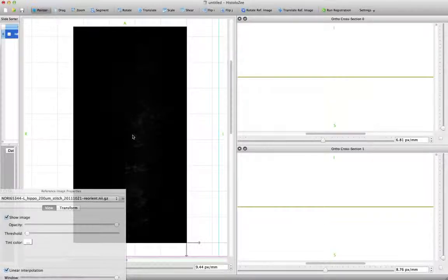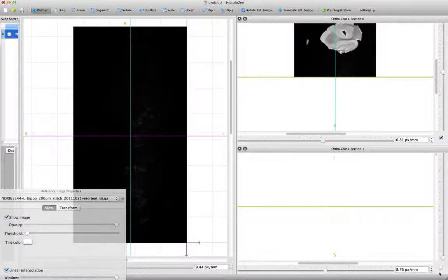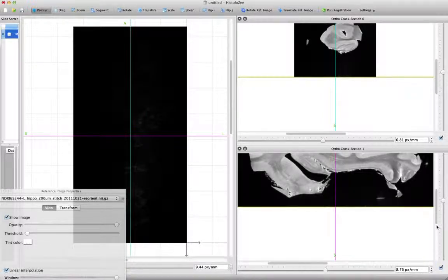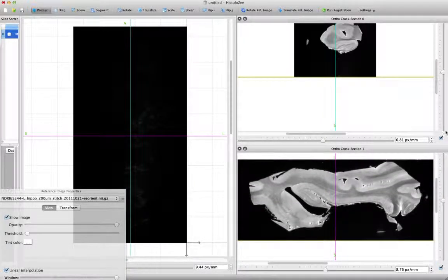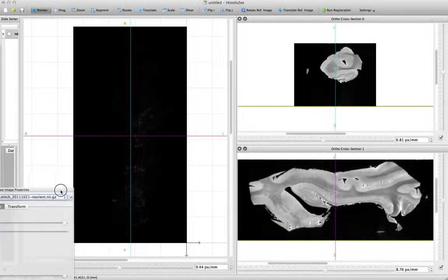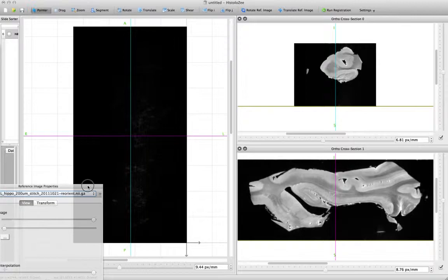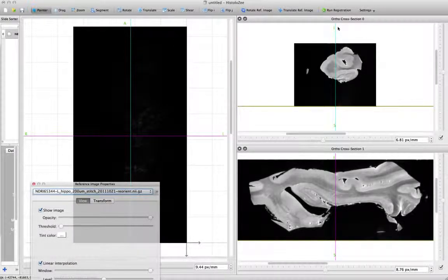What I'm going to do is click on the center of the image, and then this little box here fixes the vertical horizontal aspect ratio of the orthogonal view. And again, do it to this one. So now we have our three views. The first view shows AP top to bottom and right left. The second view shows inferior superior.